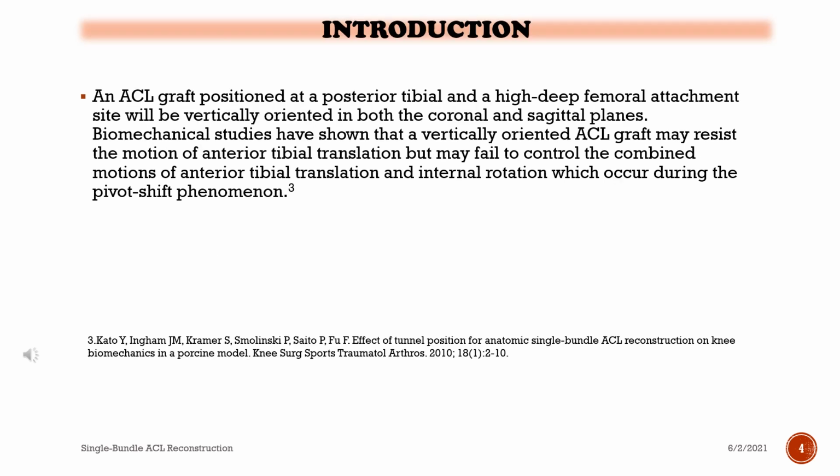An ACL graft positioned at a posterior tibial and a high deep femoral attachment site will be vertically oriented in both the coronal and sagittal planes. Biomechanical studies have shown that a vertically oriented ACL graft may resist the motion of anterior tibial translation but may fail to control the combined motions of anterior tibial translation and internal rotation which occur during the pivot shift phenomenon.